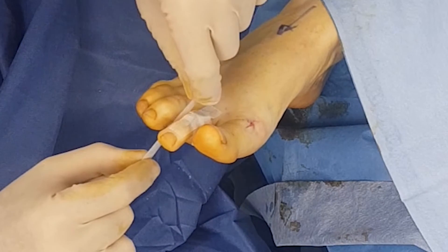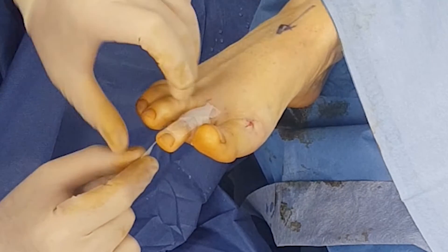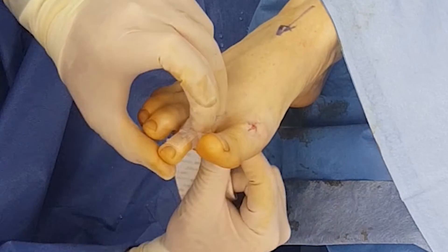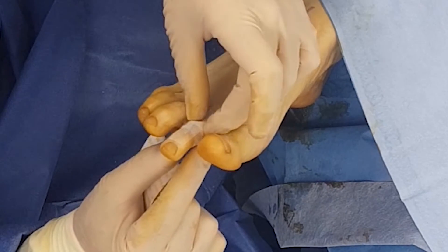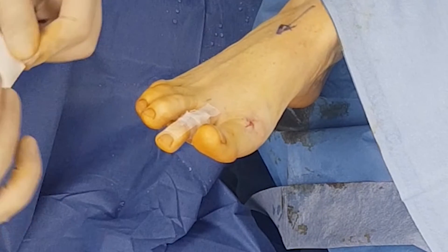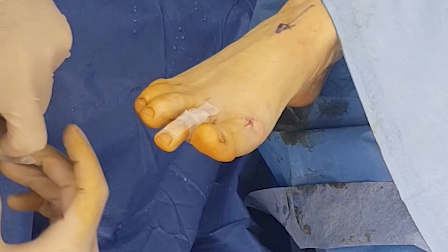So guys, that is pretty much how you perform a PIP joint arthrodesis or fusion with percutaneous release of the extensor digitorum longus of the second toe. Thank you.